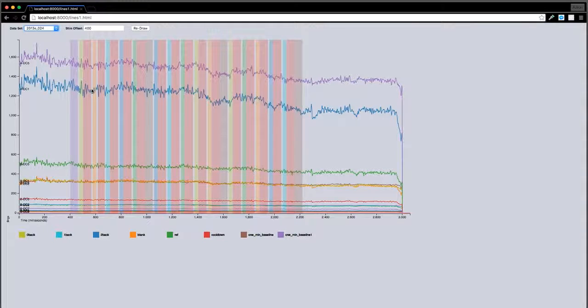Moving forward, I'd like to add a little bit more detail to this interface, so the ability maybe to zoom in or maybe mouse over to collect details. And one cool thing about D3 is it's a pretty flexible library. So it took a second just to get spun up, building the graph based off the data, but now that it's up and running, it's fairly flexible in drawing new things on the screen based on user interaction.